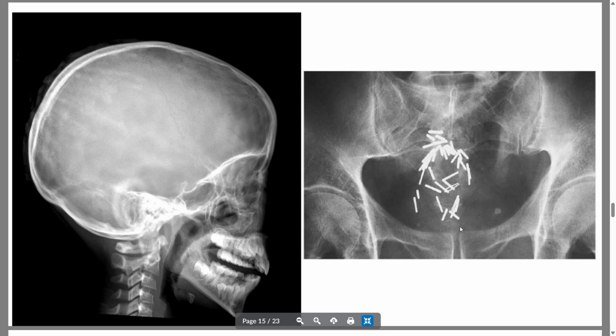usually pose a problem. However, for this guy, we know this is a guy because this is a very common presentation. He has these radioactive beads implanted in his prostate. This is a really common therapy for prostate cancer. So this patient is receiving kind of active radiation therapy to their prostate with these embedded beads.